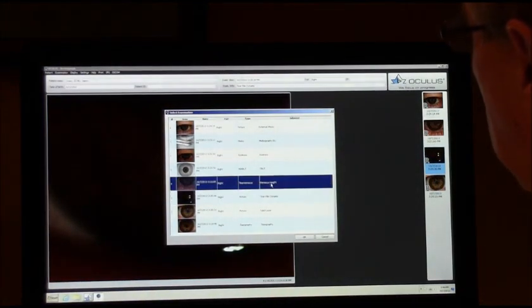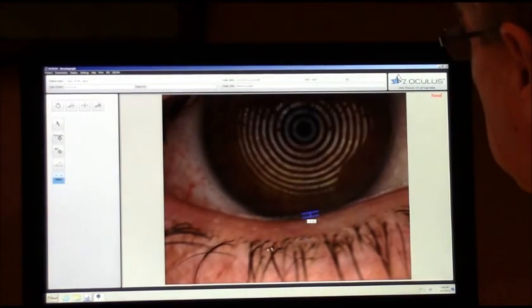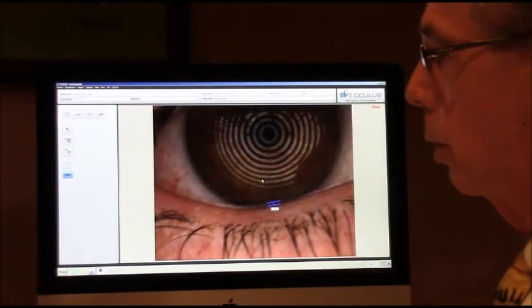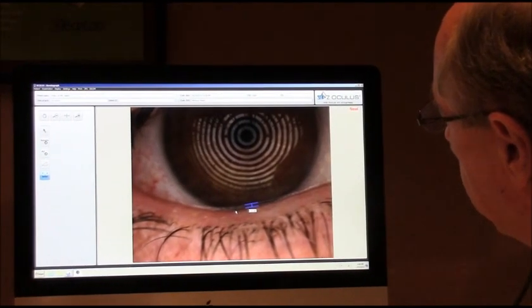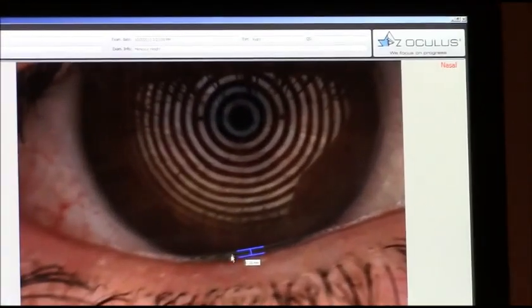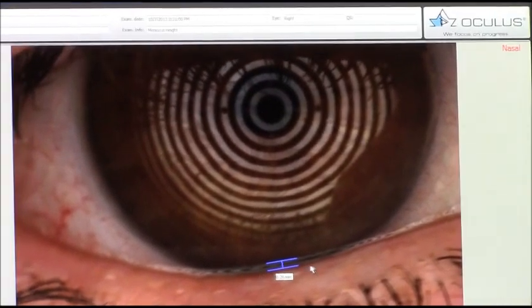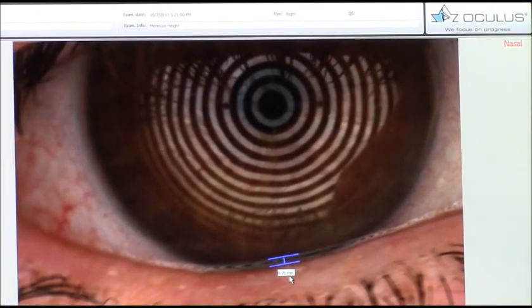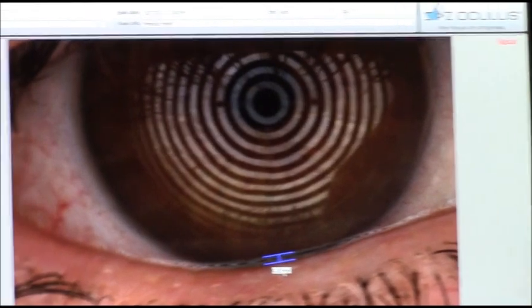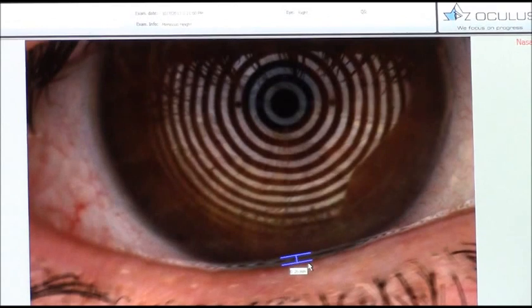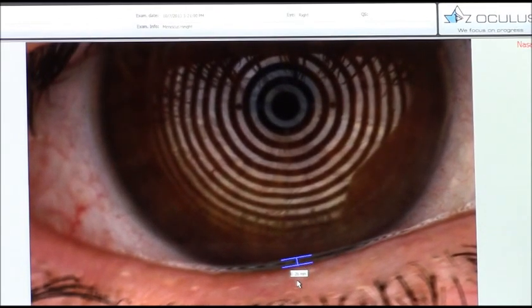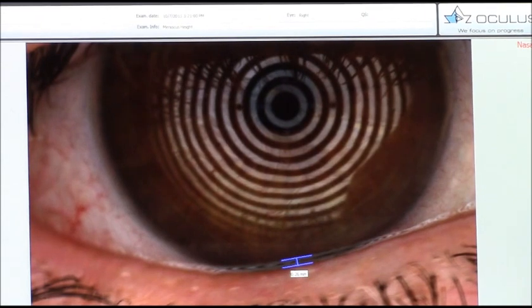The next test looks at the tear meniscus height. This measures in tiny detail how much tear film is present along the lower lid margin. We can measure down to tiny fractions of a millimeter. This reading is 0.26 millimeters in height, which is at the lower limit of normal. Anything below that indicates dry eye; anything above that is pretty normal. So we can measure exactly how dry someone's eye is.